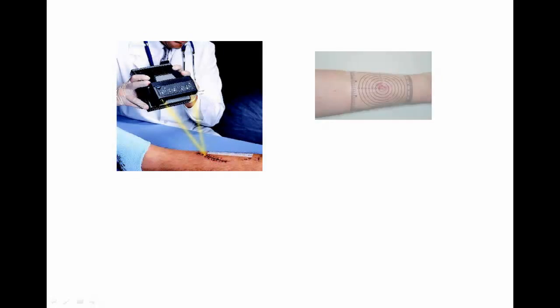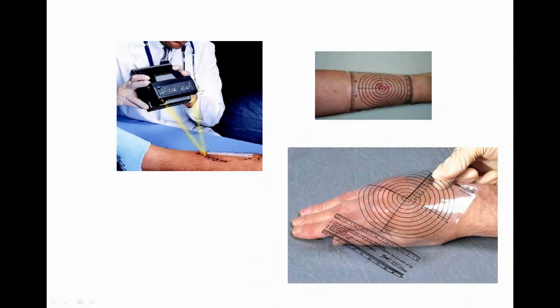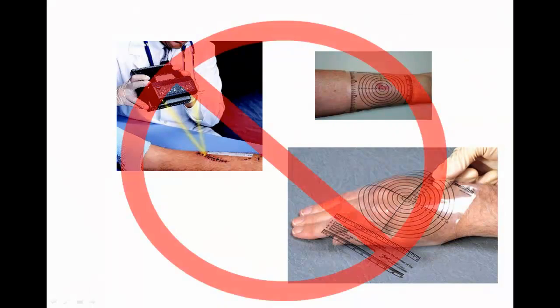Now, the next thing that has become important is actually having something that's accurate. Current Medicare requirements require, in order to use certain CPT codes, an accurate measurement. What I found from testing, and we've done some testing with nurses, is that the overlays are not accurate. The Polaroid camera was nice, but it actually gives you no better of a measurement than an overlay because you have to estimate the area just by looking at it.